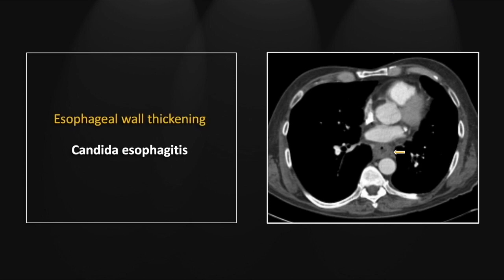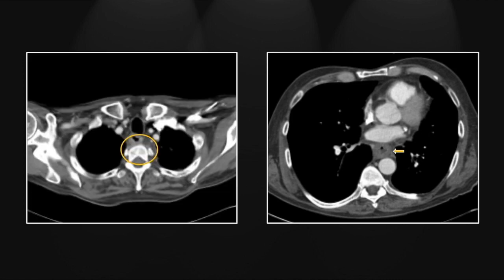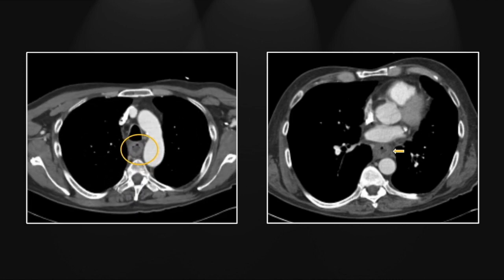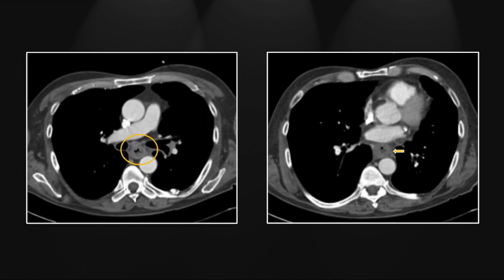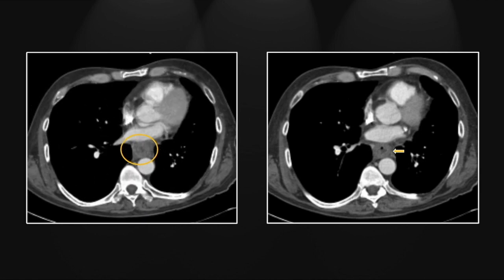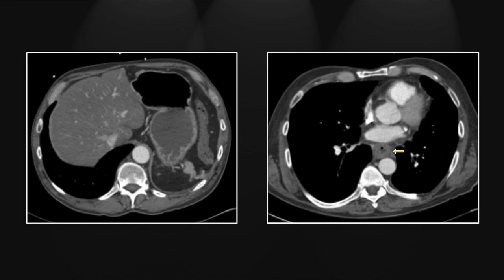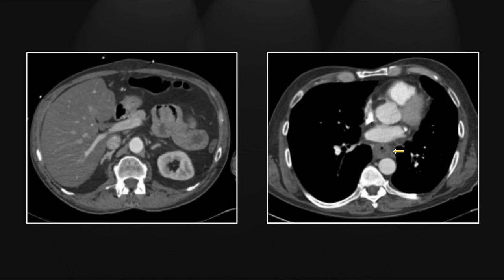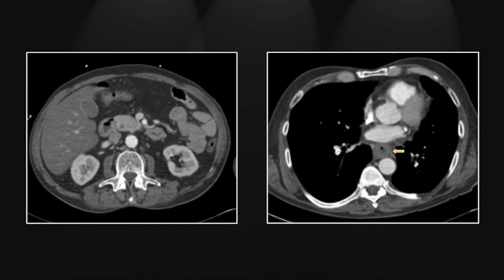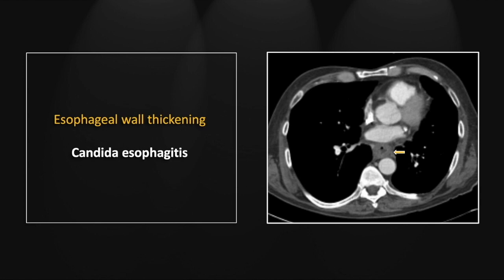There is extensive wall thickening throughout the length of the esophagus, and note as well the enhancement of the mucosa consistent with inflammation. You can really appreciate the extent of that wall thickening, which is present throughout the entirety of the esophagus. And it is that extent that should at least make you consider the possibility of candidal esophagitis, as opposed to reflux esophagitis or the more common forms.